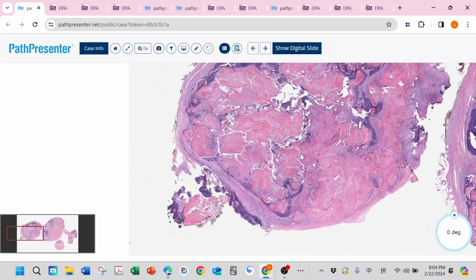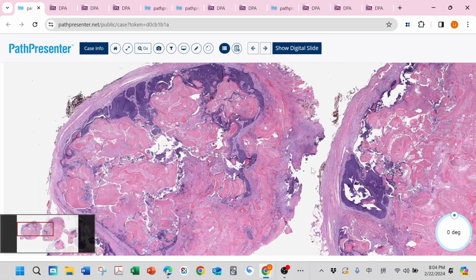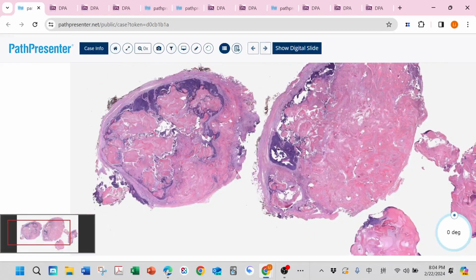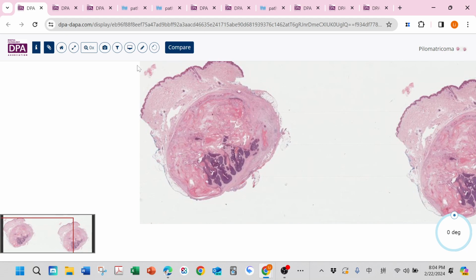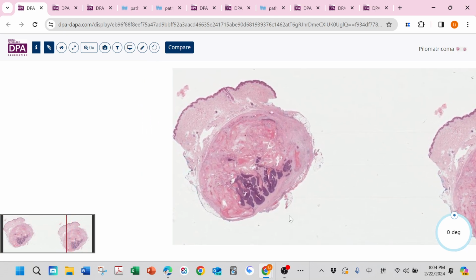But if you see really polymorphic primitive cells, a really big infiltrated border, and cytology that is really atypical, you may also be suspicious for pilomatrical carcinoma. Let's see more examples of pilomatricoma. Even in low power, we know it is well demarcated, basaloid cell, ghost cell.